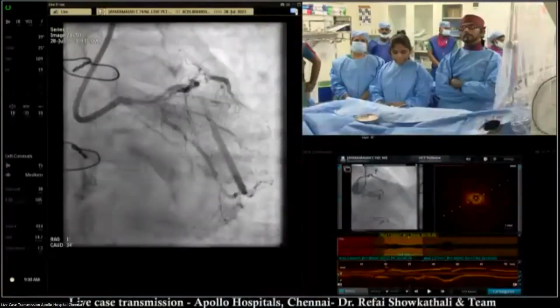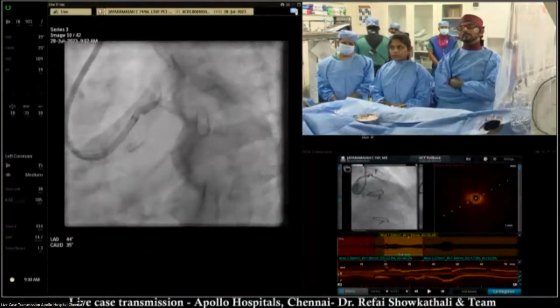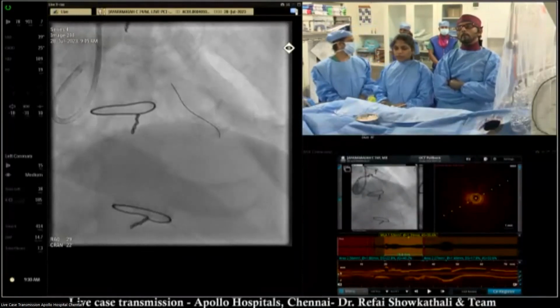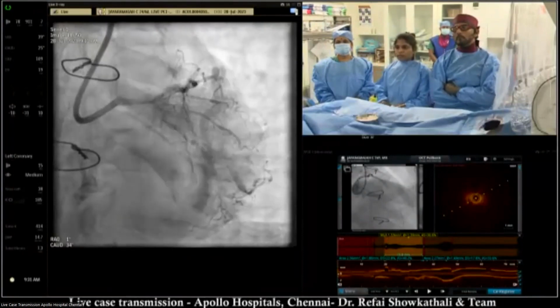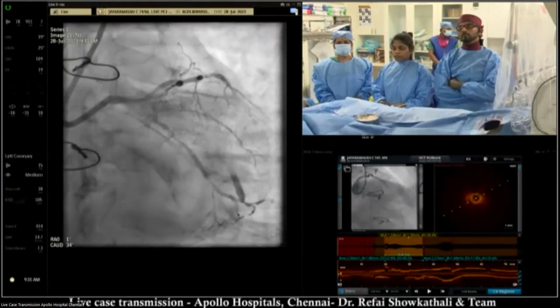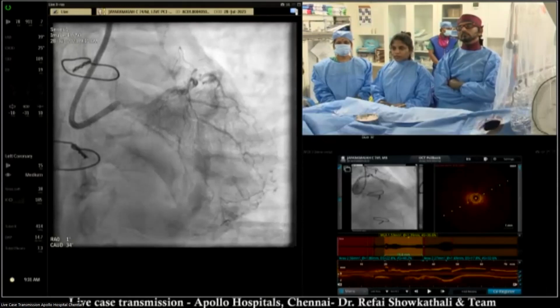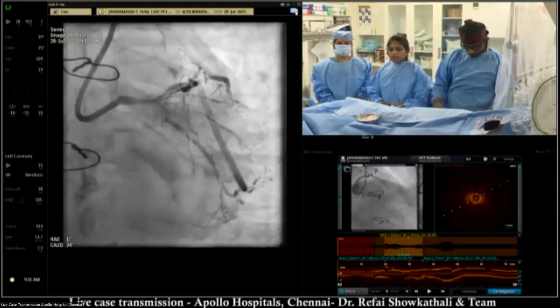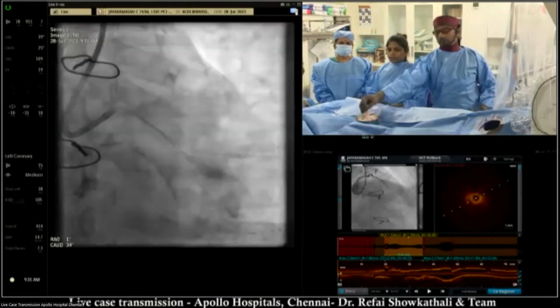Dr. Sunil, how would you approach this, Dr. Modi? Okay. Left main to LAD, obviously. And after pre-dilatation, maybe I'll prefer OCT because the calcium can be better judged, and be prepared for some ablation strategy, rotablator or anything new, whichever you want to use. Because we have experience of rotablator far more than these newer ones, in case it is required, I'll go for rotablator first. Okay.